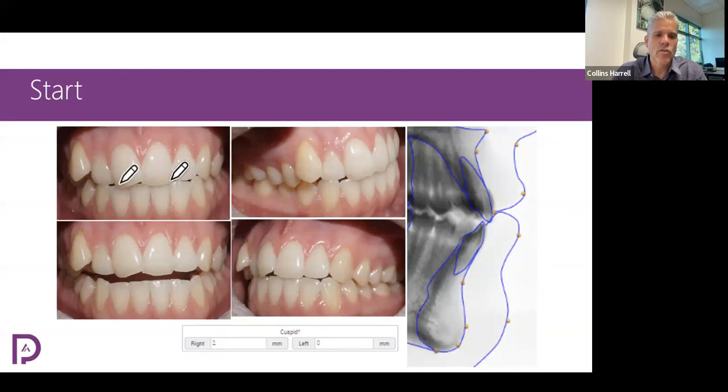I see that we don't have any overbite. It's less than 1 millimeter, but it does look like we have some slight contacts. It doesn't look like she has a tongue thrust habit where she has kept her teeth from actually having contacts in the front, but she doesn't have very much overbite.